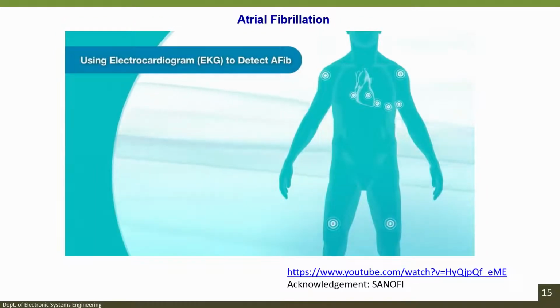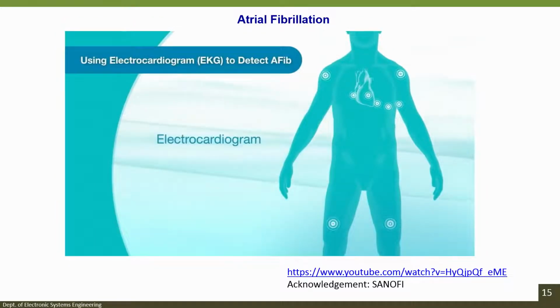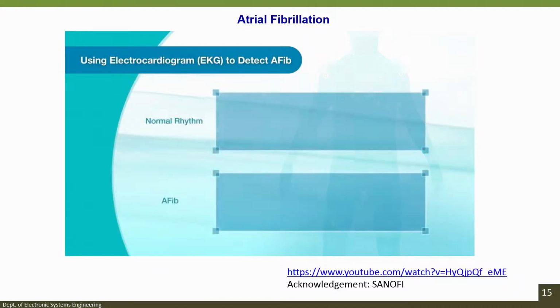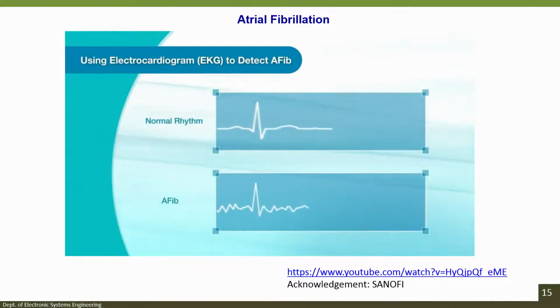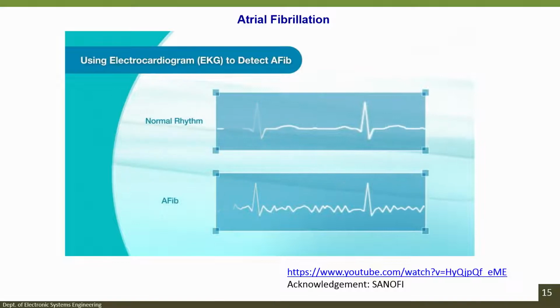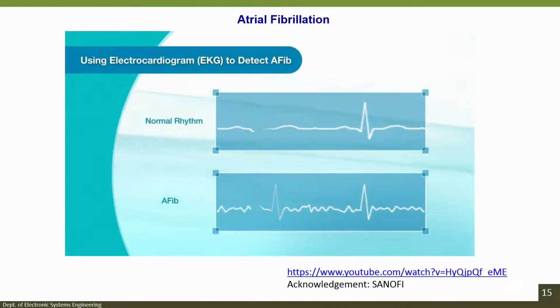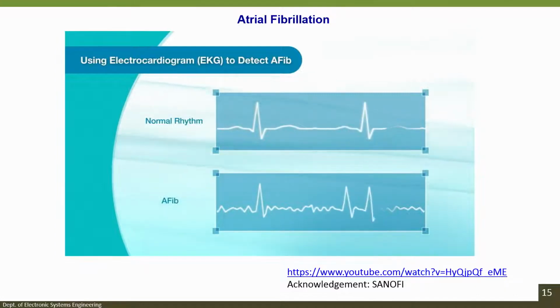Your doctor may perform a test called an electrocardiogram or an EKG to see your heart's electrical activity and rhythm. During an EKG, small electrodes are placed on specific parts of your arms, chest, and legs using small stickers. When the heart beats, the electrodes send signals to the EKG machine. The EKG measures the electrical impulses or waves shown here as lines.